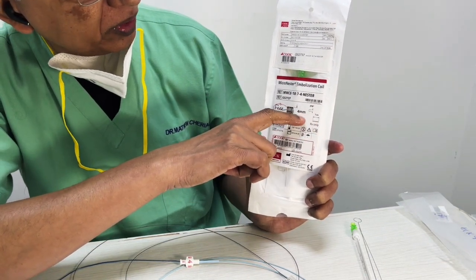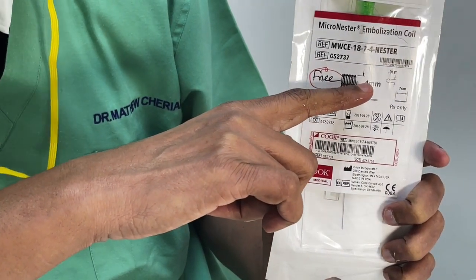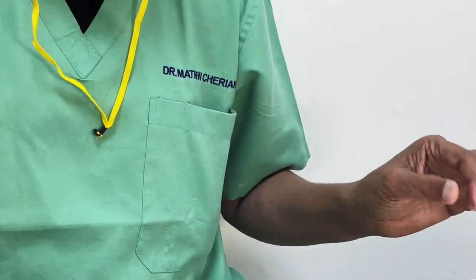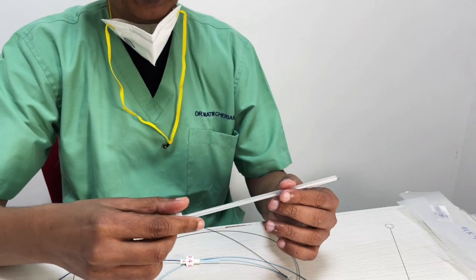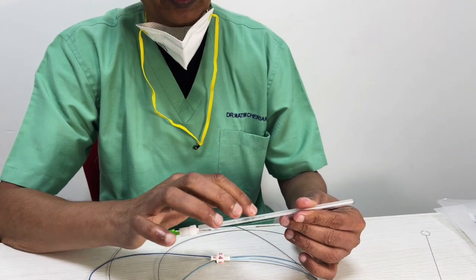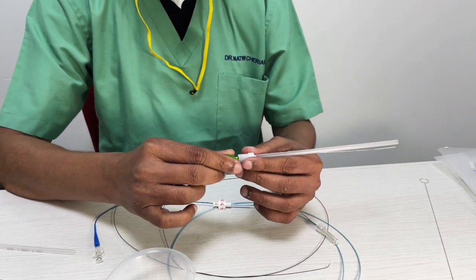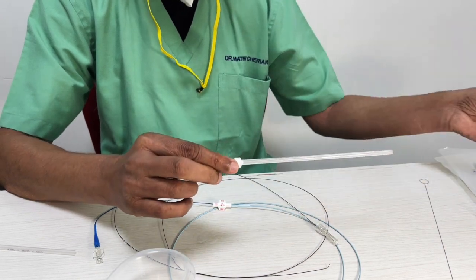Be very clear of what you do, because this is for a vessel which is 3 millimeters. You cannot use this for a vessel which is 5 mm, it will just fly off. And if you use it in a vessel like 2 mm, it won't coil. So you have to see this. And here I've got a coil already open to demonstrate it to you. Again, it comes in a similar packing, and they have written the same thing on top of this as a 6x14 coil. Make sure these are confirmed, because this is where you can make a mistake if you change your size. Otherwise, technically, it's very, very similar to putting that, except that they give a pusher.